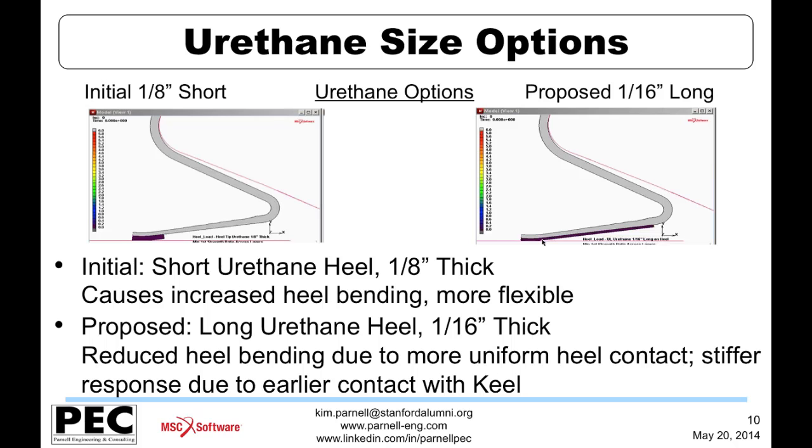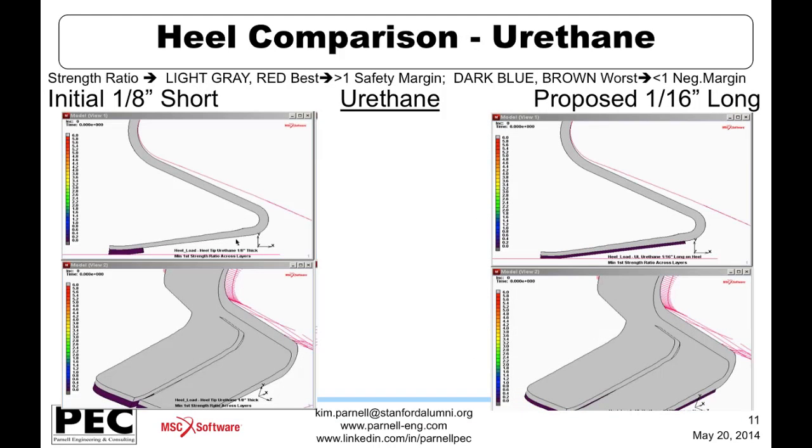So one thing that we're going to see by utilizing a nonlinear finite element analysis is to be able to include the effects of contact and large deformation and rotation of the components. And I'm utilizing the solid shell elements in Marc in this model that allow you to specify layers of material. They can also be defined on a per layer basis, but you can define groups or layups of material of specific orientation and thickness. And again, a couple of different views of looking between here.